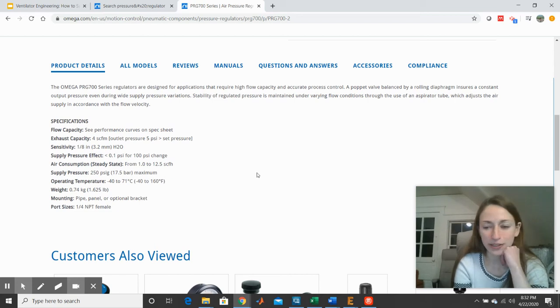And then I'm going to drop down again to the specifications. So we can skim these and see if it works for our purposes. I'm not totally worried about the exhaust capacity just from this, because we're not really operating within this pressure range. Sensitivity is pretty reasonable. Our upper limit is 40 cm H2O. The sensitivity here is an eighth of an inch H2O. So this is tolerable.